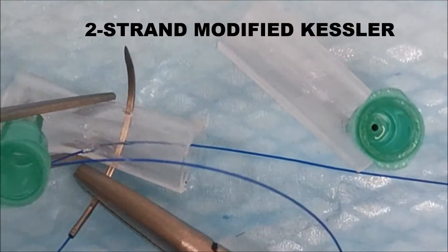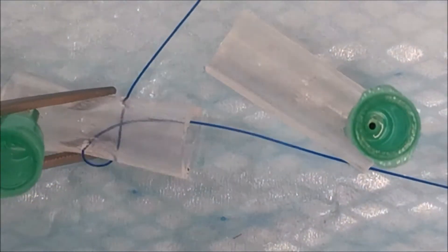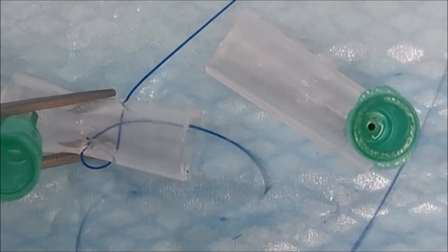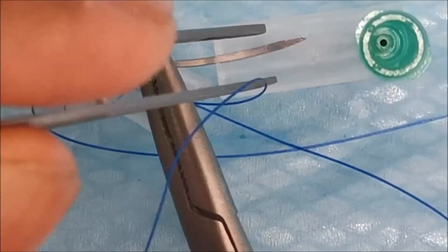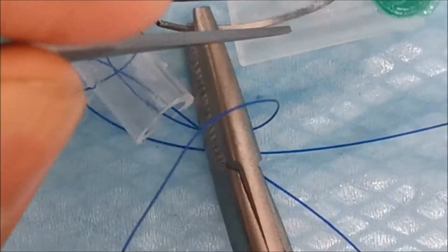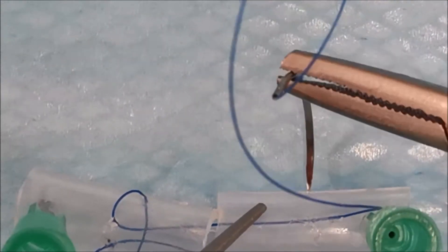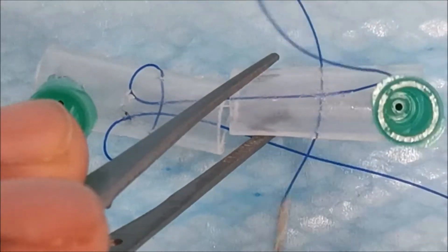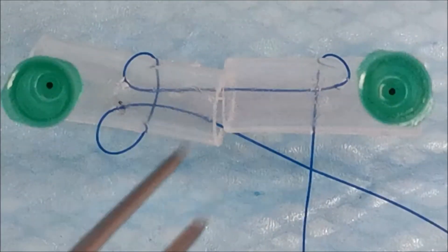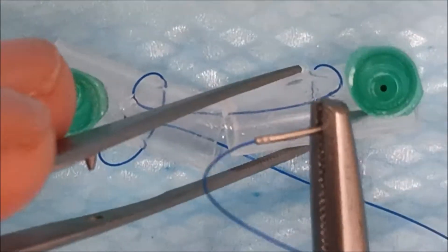We'll demonstrate the same technique with a hollow tube so you can see what it looks like on the inside. The transverse bite has just been taken and the longitudinal bite. You can see that the transverse bites cross the longitudinal bites and create a locking grasping loop which grasps a few of the tendon fibers.